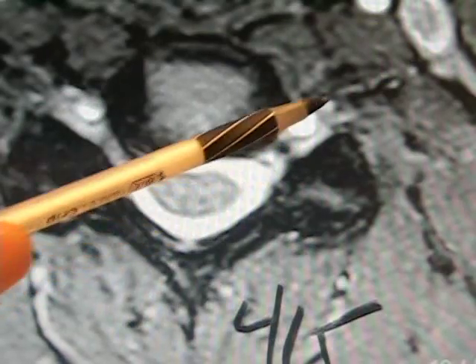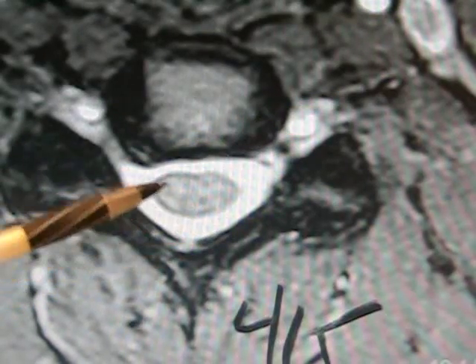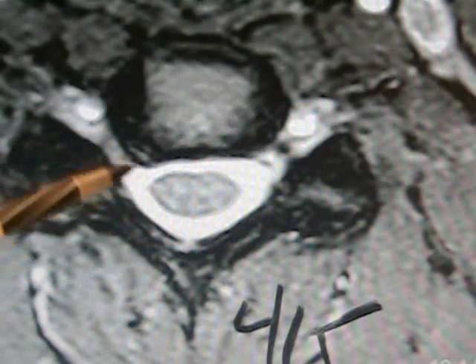This is another axial image, again at the C4-5 level, and in this case we see a normal hole where the nerve exits here, and on the other side the hole is somewhat narrowed. In this particular case, the nerve could be compressed as it exits through that hole on the picture's left side, which is actually the patient's right side of the body.